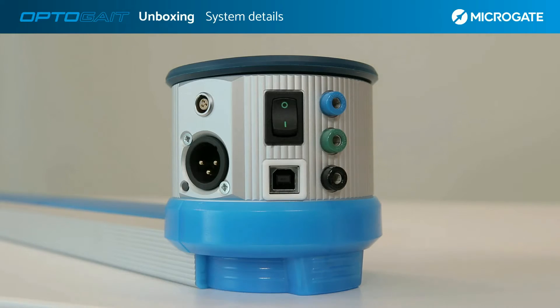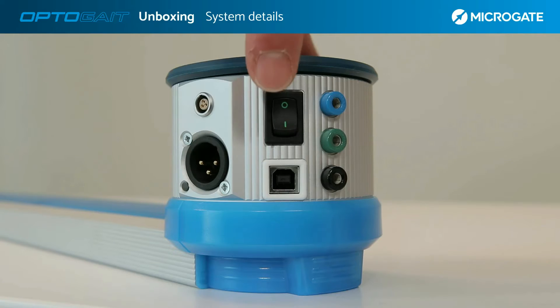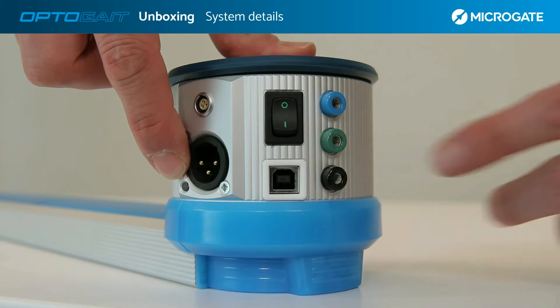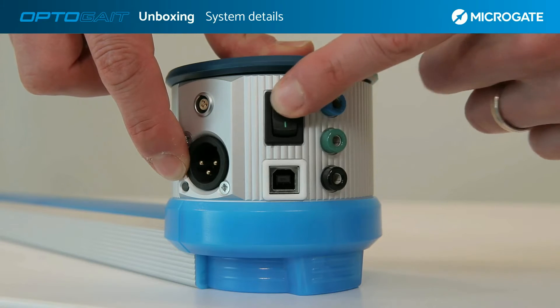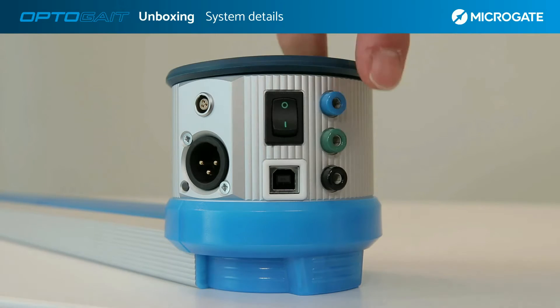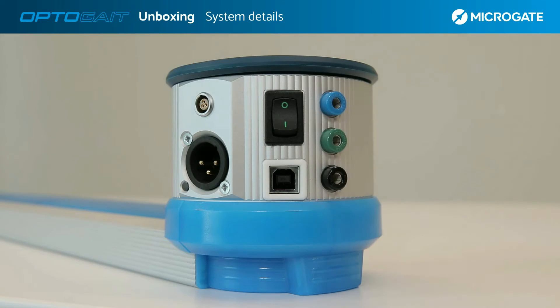The interface is characterized by one input for a three-pin power connector for the power supply, and a switch that allows the individual bar to be switched on and off. When switched on, a dedicated LED displays the charging status of the bars. Below the power switch is the USB type B port for connection to the computer with the supplied cable. The interface also has three bushings for managing an external event and, finally, a connector for electromyography devices. For details, please refer to the manual in section 3.4: OptoGate electromyography connector.